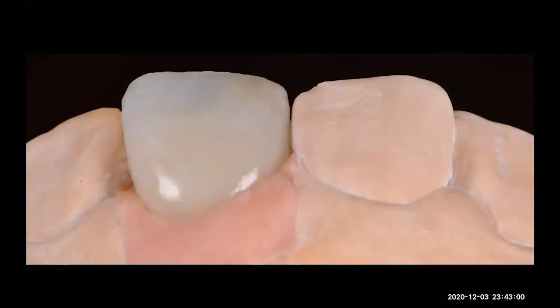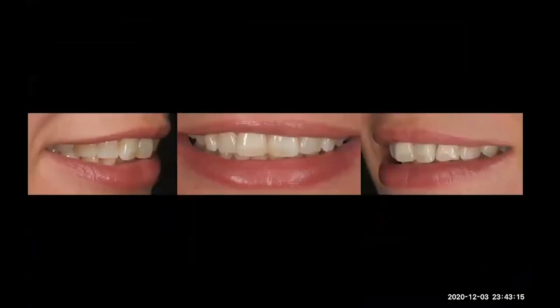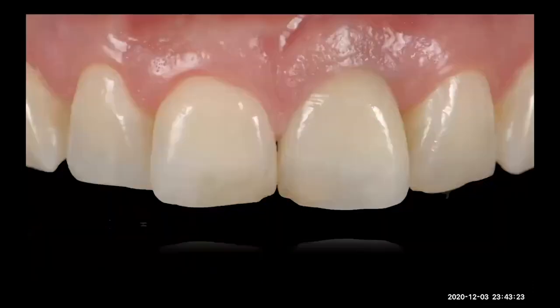And then this is the crown glazed. Of course, I sent two crowns to him in Mexico because we are at a distance. So I made two crowns and sent two crowns to him. He did the cementation, and this is the crown in the mouth. This is the scoop technique, crown in the mouth. This is the polarized picture. This is our one year control of the crown.